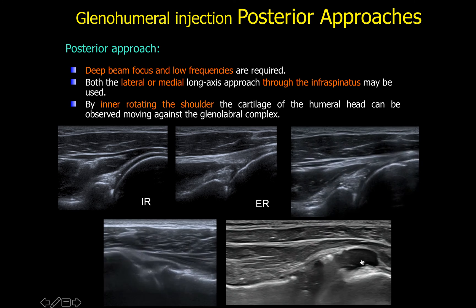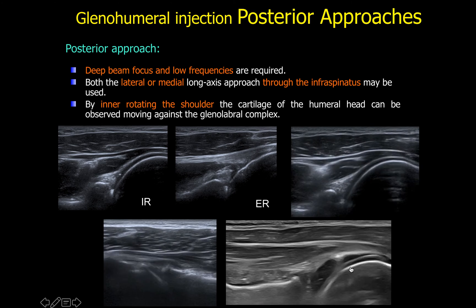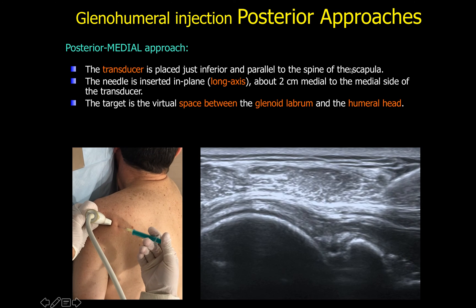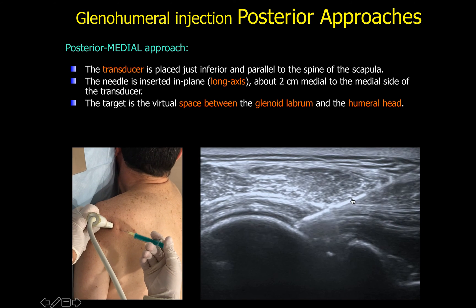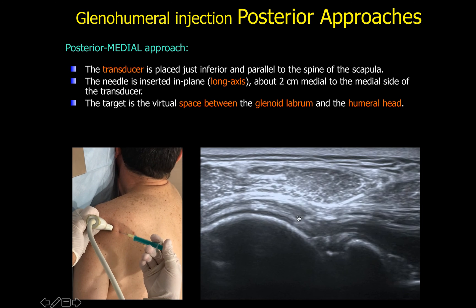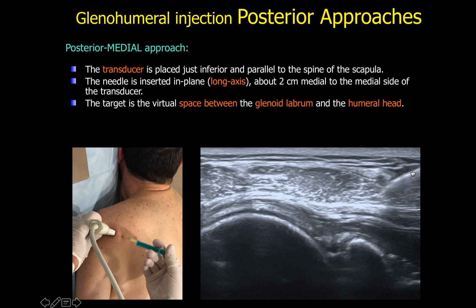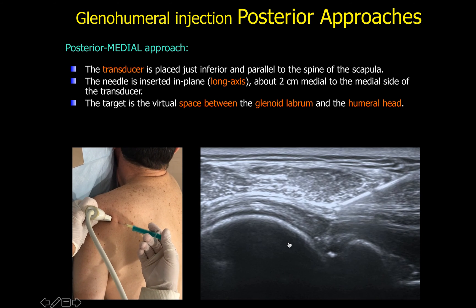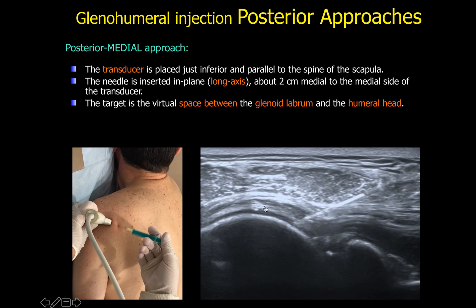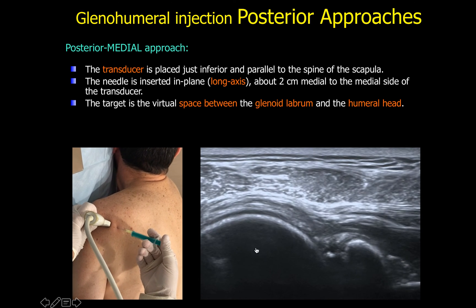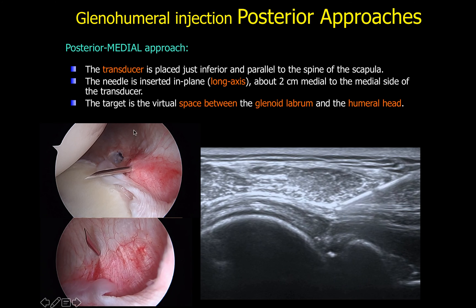When cartilage is clearly visible on ultrasound, you are over the joint space and beneath the infraspinatus tendon. The posterior medial approach is the most commonly used technique; targeting the space between the labrum and the humeral head, the needle is directed very perpendicular to the humeral head, and reaching the cartilage confirms you are inside the joint and through the capsule.